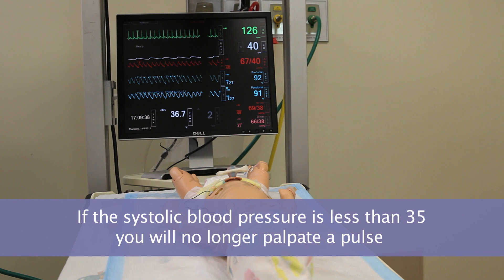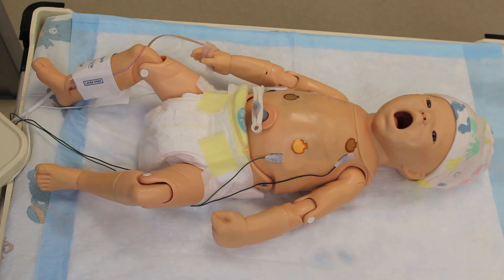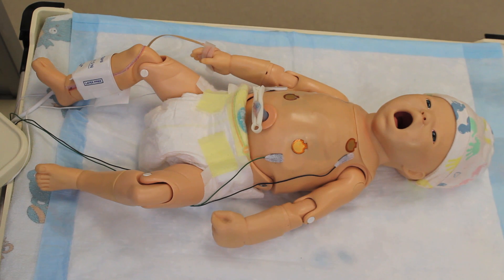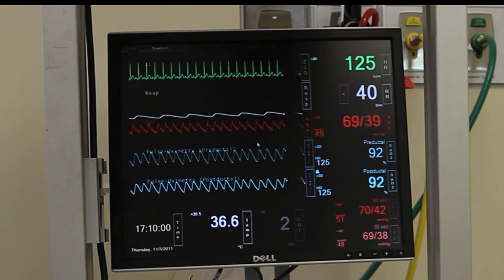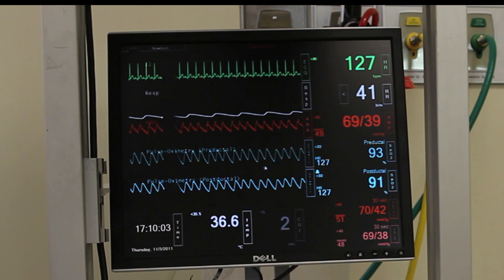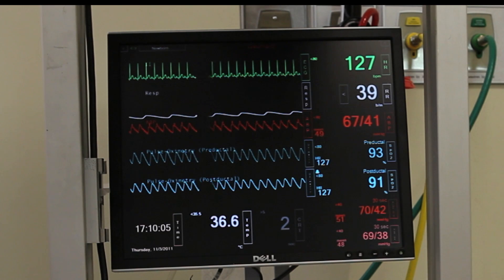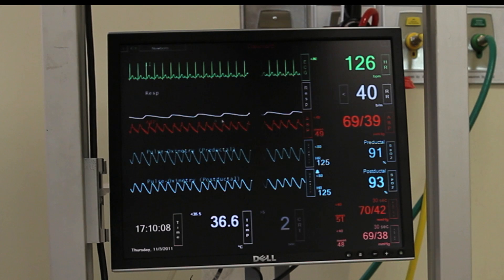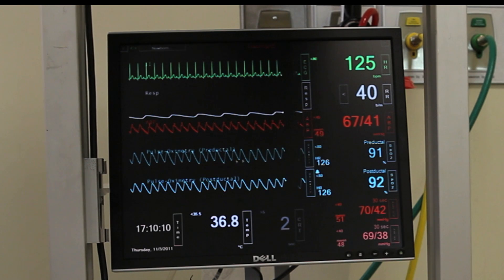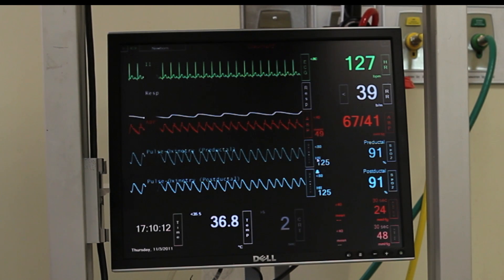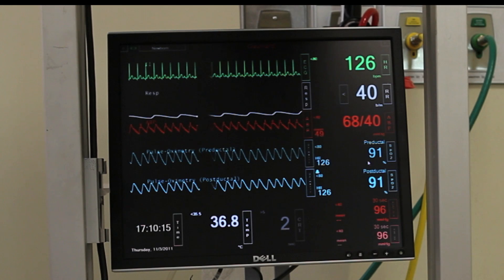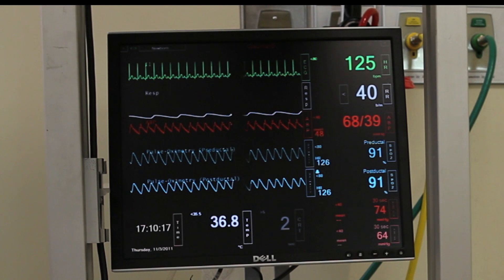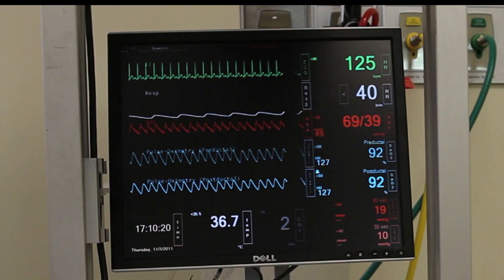If the systolic blood pressure is less than 35, you will no longer palpate a pulse. That does not necessarily mean the baby is in pulseless electrical activity, because you will still see an arterial waveform and an oximetry reading. If we're trying to show pulseless electrical activity, the arterial waveform will flatline, the oximetry waveform will flatline, and instead of getting a number, you'll get a question mark. Then you should take action to reverse pulseless electrical activity.